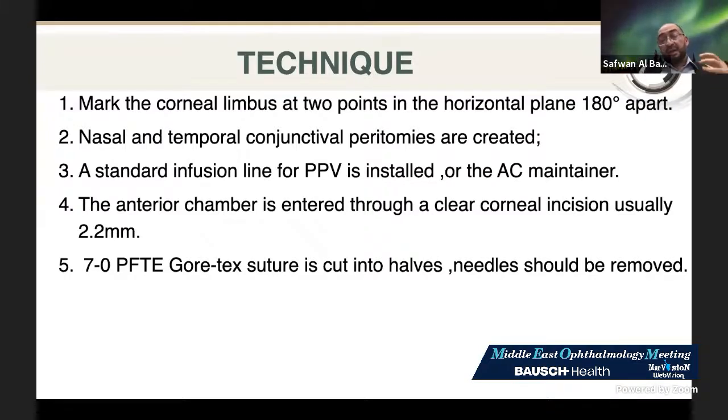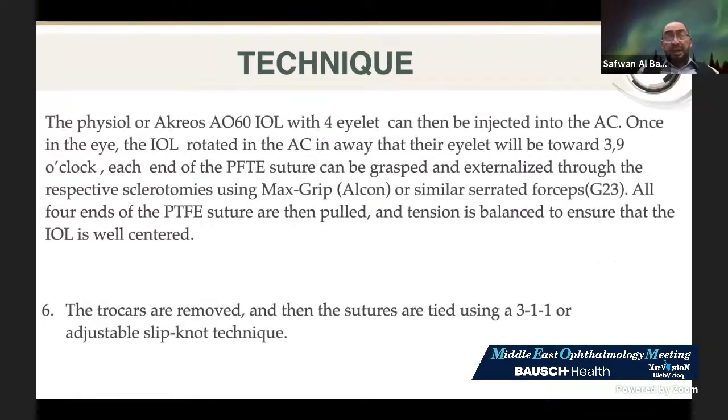The Gore-Tex suture is cut into halves. The needle should be removed, meaning that I will not use a needle here. I'm using a foldable hydrophobic IOL, or theoretically we can use the hydrophilic one, as Carlos said, but I don't prefer it. The IOL has 4 eyelets. Now, I know that Carlos has a lot of comments on what I'm saying, but anyway, the hydrophobic IOL, I feel that it's very easy to use and has fewer complications.